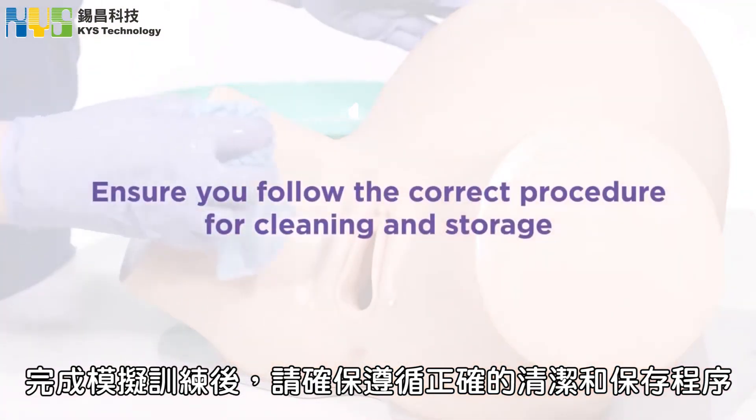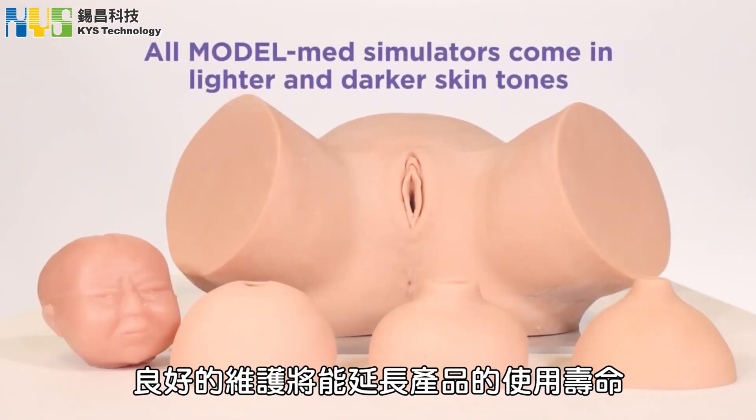Once you have finished your simulation, ensure you follow the correct procedures for cleaning and storage. Proper maintenance will ensure the longevity of the products. If you have any further questions, visit the ModelMed website.